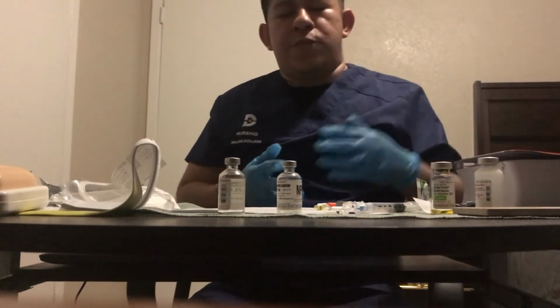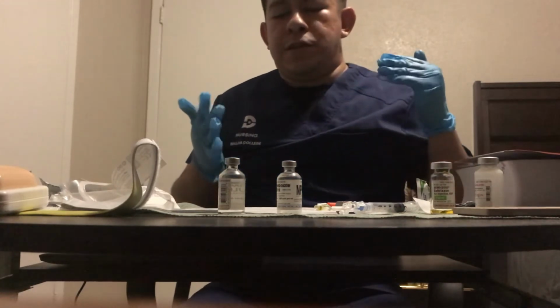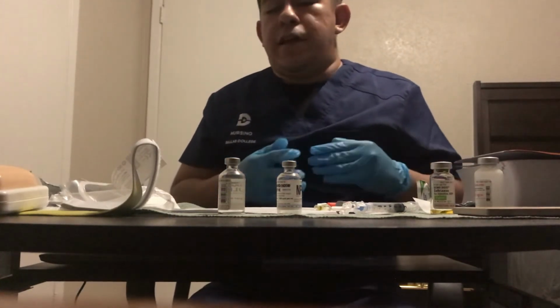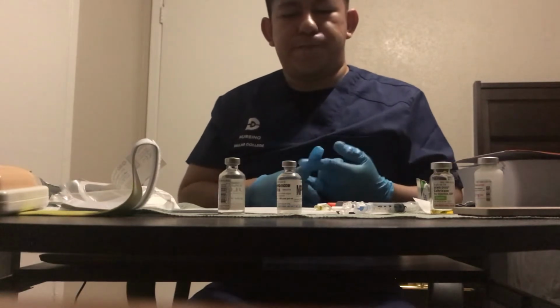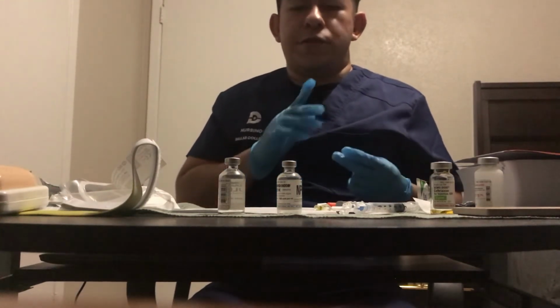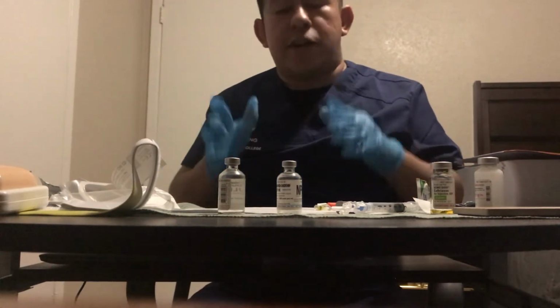And I would explain the procedure. So I would say, so Mr. Buzzard, like I said, I'm here to give you your 7 a.m. injections. And what I have for you here is ceftriaxone, which is your antibiotic. And then I have your insulin, which I'll be giving you now that I see that you have your breakfast tray just got here.